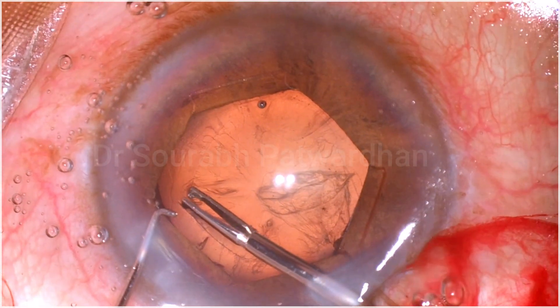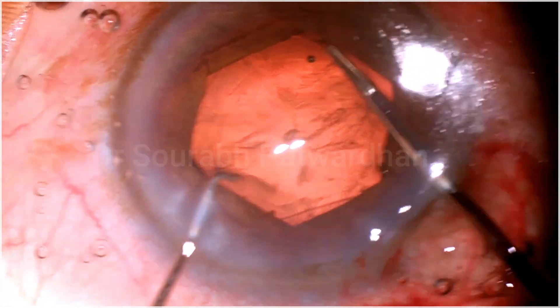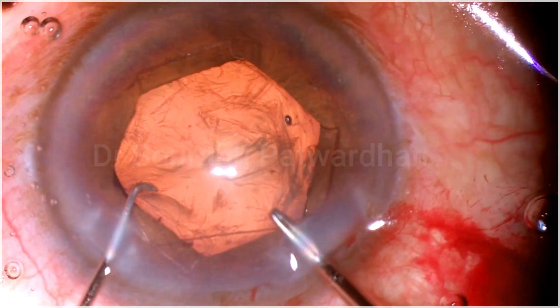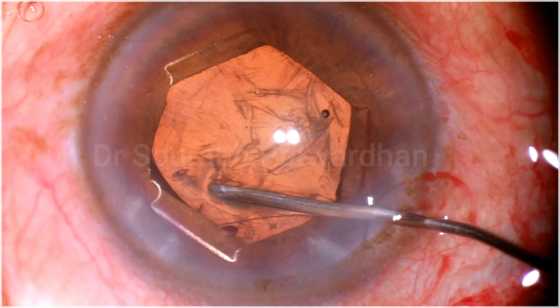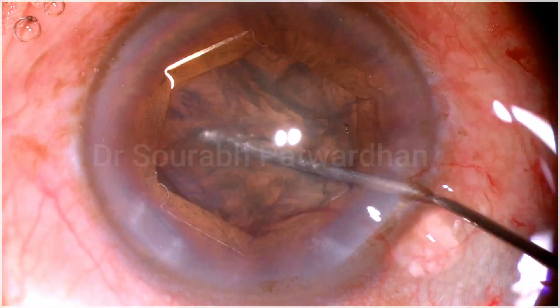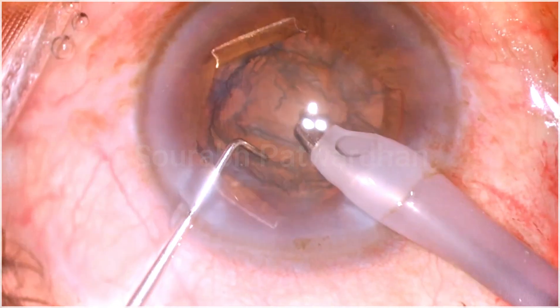I made a tangential tear using a micro scissor and then using micro forceps I am enlarging the capsulorrhexis. It's very important in these cases that you have a 5 mm capsulorrhexis — that was the primary reason I decided to use a pupil expansion device, because I knew the CCC was small. Controlled hydrodissection is the key. If I inject a lot of fluid, the iris can still prolapse despite using the pupil expansion device.